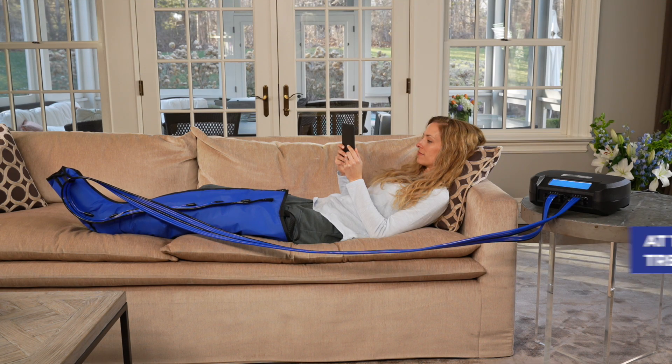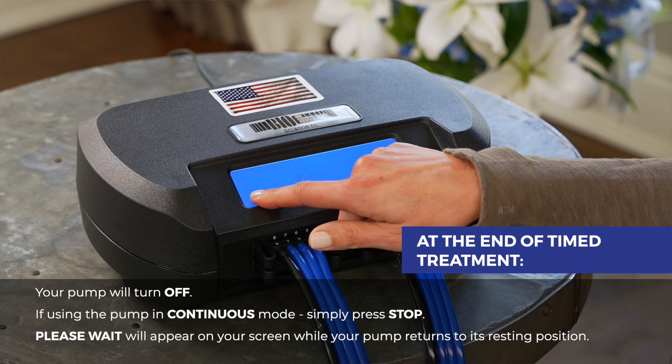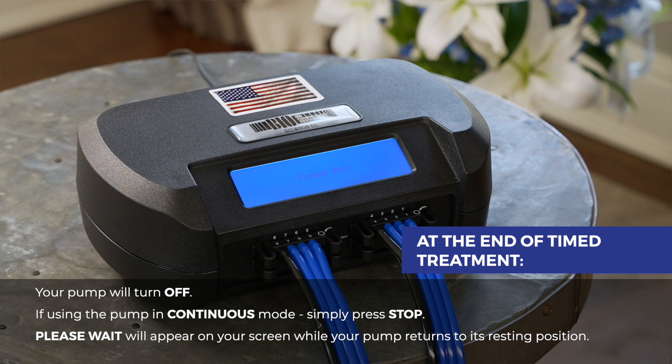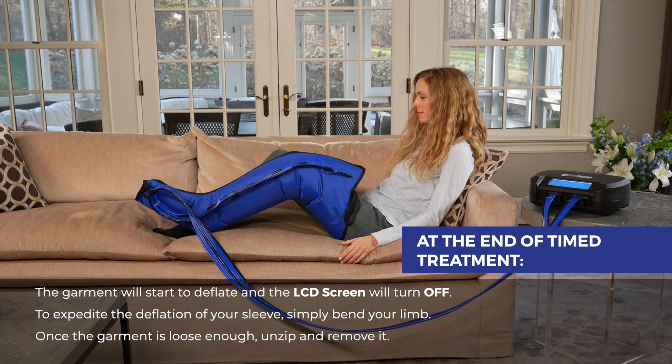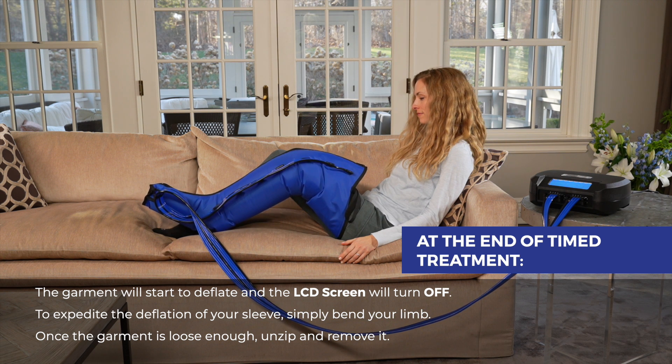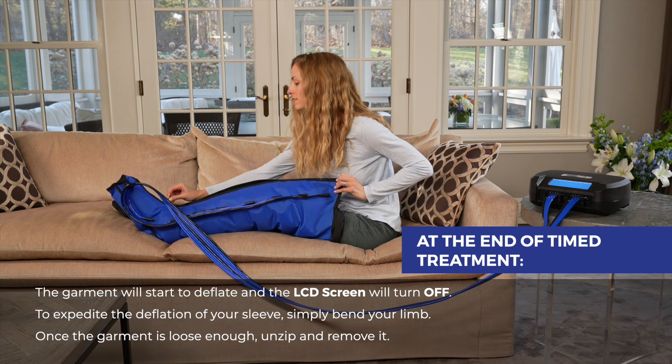At the end of a timed treatment, your pump will turn off. If using the pump in continuous mode, press stop. Please wait will appear on your screen while your pump returns to its resting position. When it has, the garment will start to deflate and the LCD screen will turn off. To expedite the deflation of your sleeve, simply bend your limb. Once the garment is loose enough, unzip and remove it.